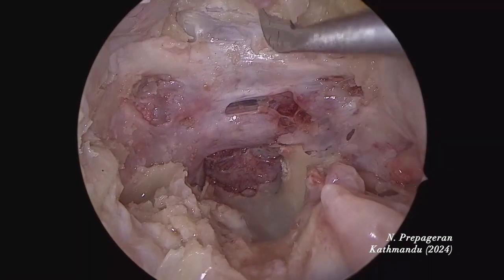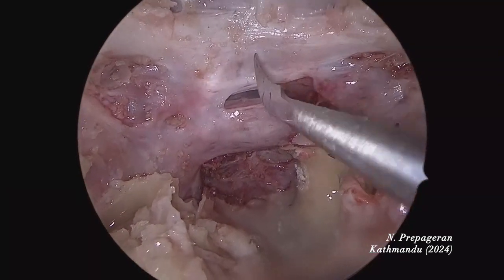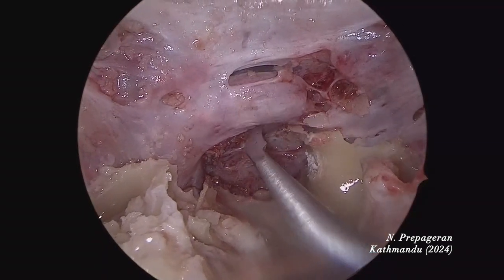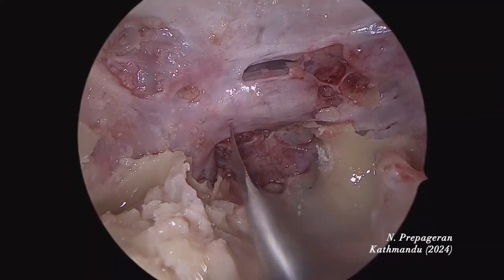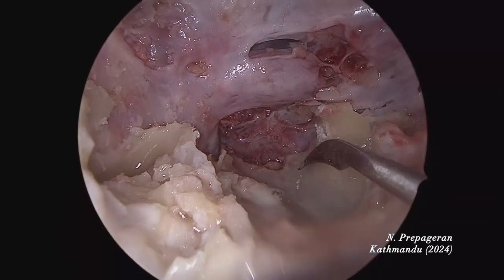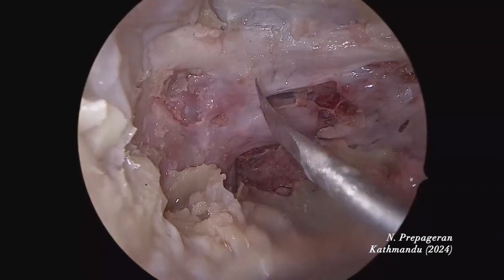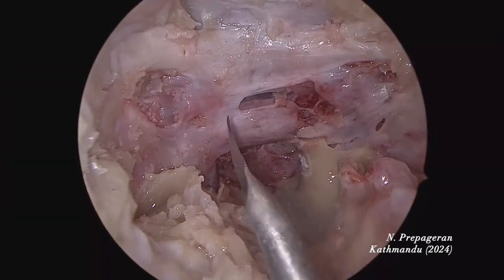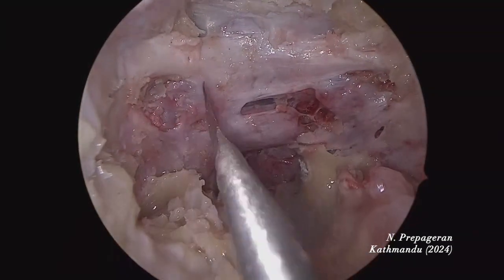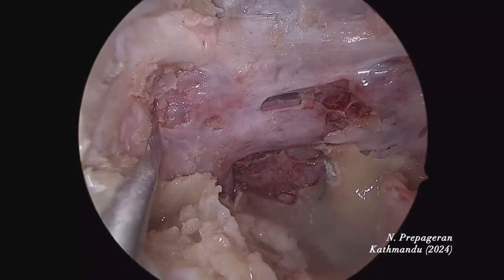Let's look at the skull base anatomy. Planum: from the anterior sphenoid all the way here — when it's sloping, that's planum. Tubercle: the vertical aspect. Sella: the bulge. Paraclival carotid, paraclival carotid. Clivus — you can drill all the way down depending on how far you need to go. Optic nerve right, optic nerve left. Carotid siphon right, carotid siphon left. Optic-carotid recess bilaterally. And this is where Meckel's cave would be — the cavernous sinus will be behind this.